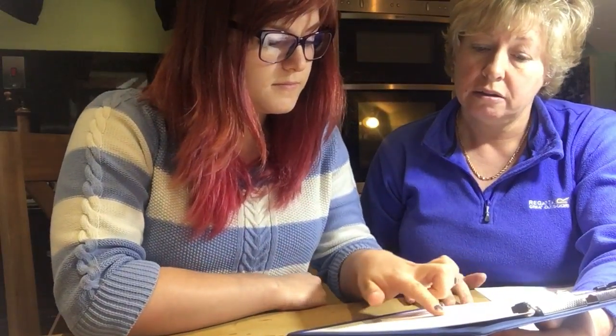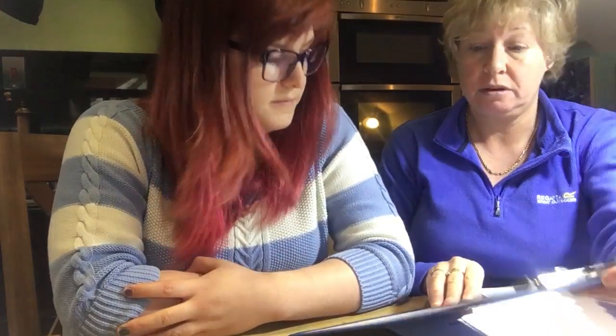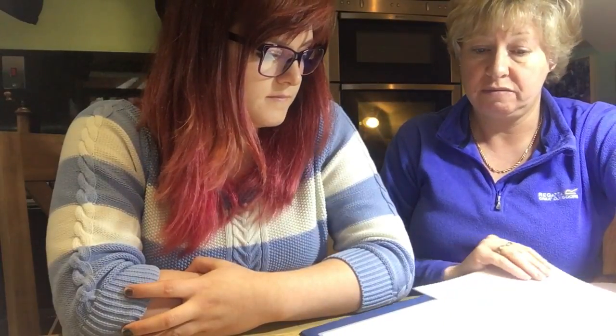The reason we're doing this is because what you're helping me to identify is your better area of vision, so that in a little while when I start to teach you the technique, we know where your better area of vision is, and that's the bit we'll be looking at optimising. So that's what we're doing this for.